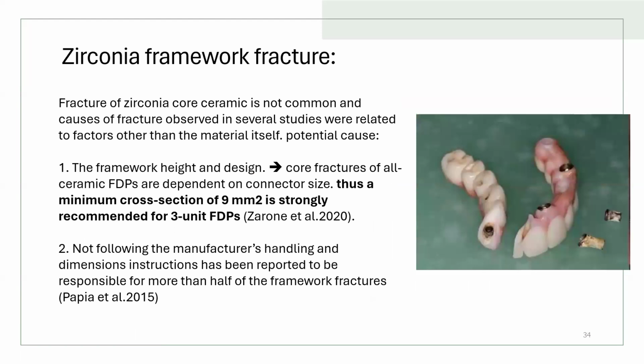Okay. Now for the zirconia-based restorations, for the bilayered zirconia restorations, there is another complication. It's not as common as chipping, but it still occurs sometimes, which is the framework fracture. And studies have demonstrated that these fractures have nothing to do with the material itself. It's related to other potential causes, as we will discuss in the upcoming slides.